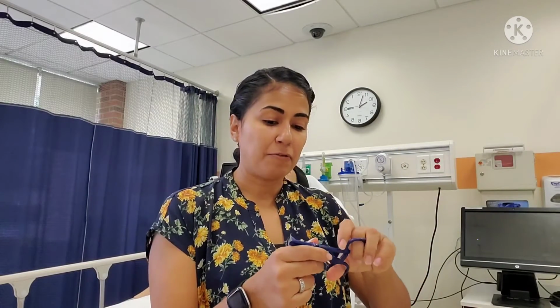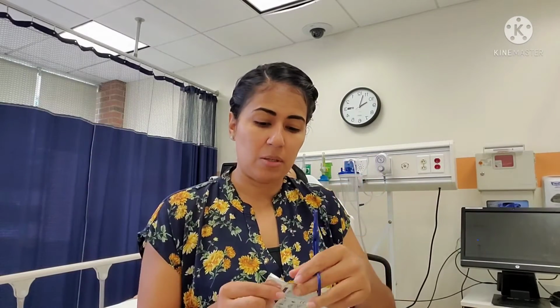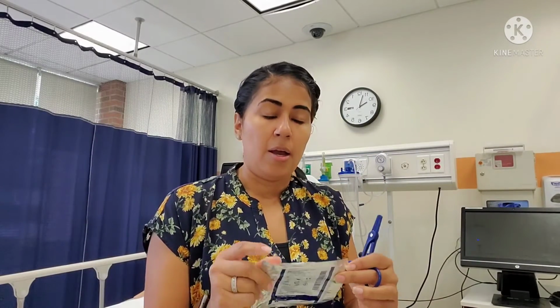But this is basically what the petroleum gauze looks like, okay? It's a Vaseline gauze. And I also have my hemostat, okay? So this is if I need to emergently clamp the chest tube, or if the provider asks me to clamp it, okay?